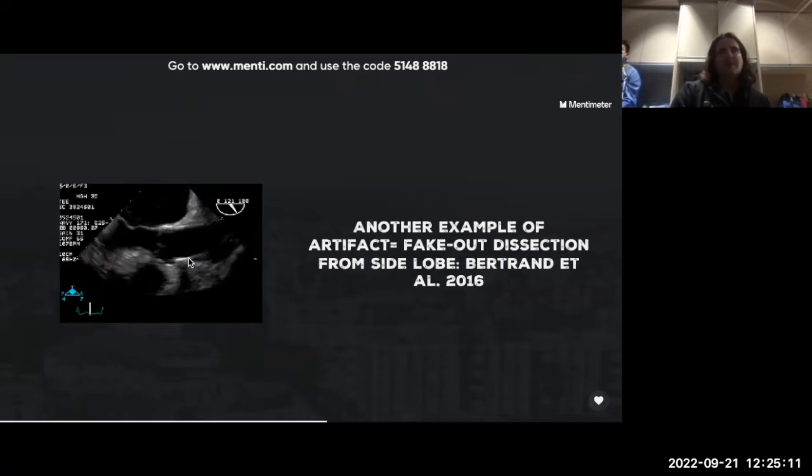But the issue is that commonly, there's the main part of the beam on an ultrasound probe, and there's often side beams too. These are grating beams, or they call them side lobes or grating lobes, and they can generate these alternative duplications. So this is being duplicated over there, and it often makes an arc. I'll show you an image why that happens. So this is a grating or side lobe artifact.